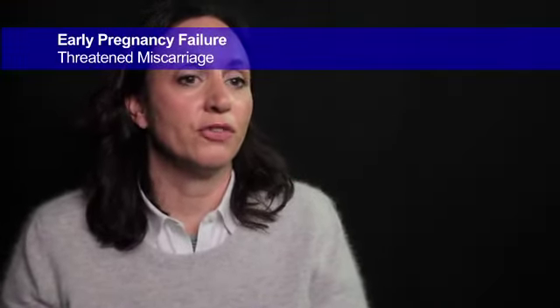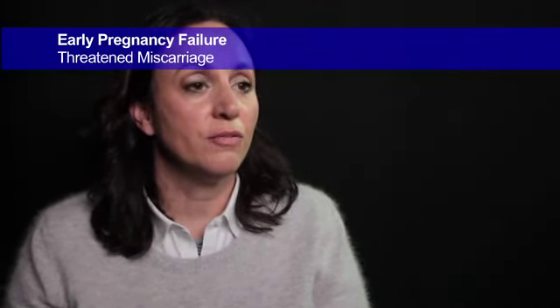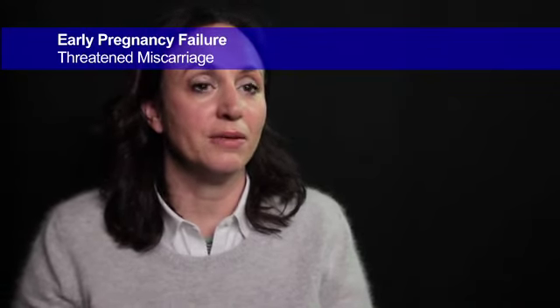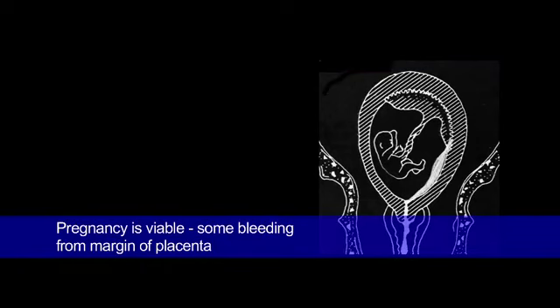Okay, so let's just dwell a little on threatened miscarriage. Threatened miscarriage is defined as vaginal bleeding presenting in the presence of a live intrauterine pregnancy. In this slide, we can see the difference between a threatened and an inevitable miscarriage. In a threatened miscarriage, the pregnancy is viable. There is some bleeding. Classically, it comes from the margin of the placenta, maybe just from the placental edge.